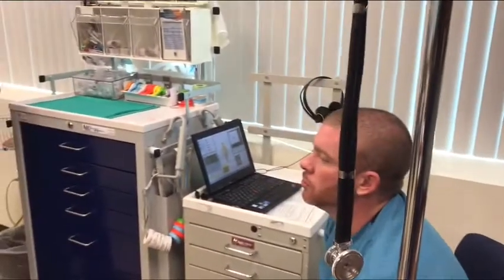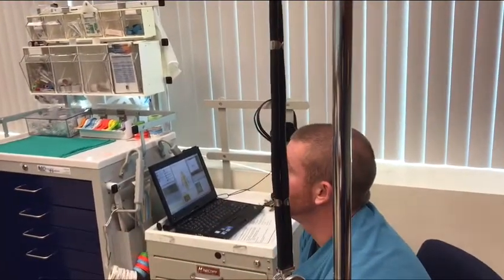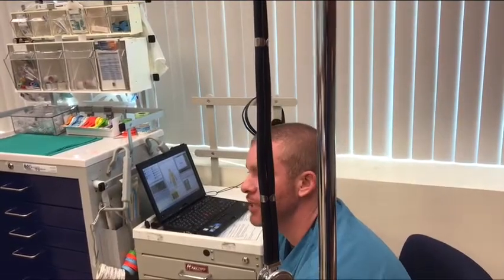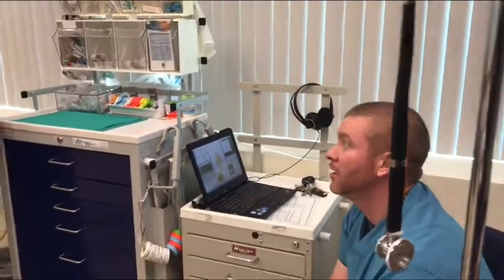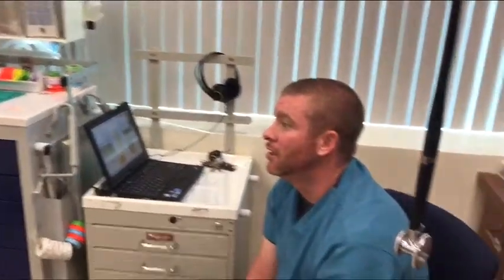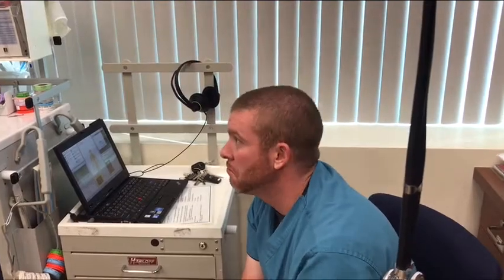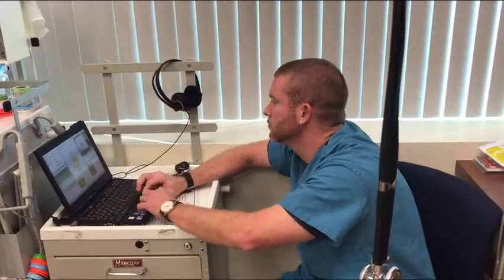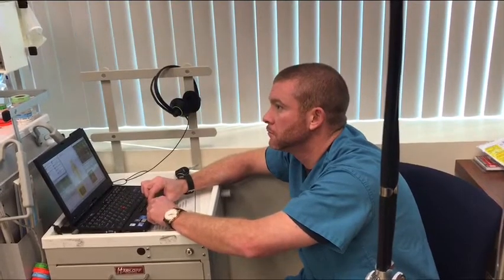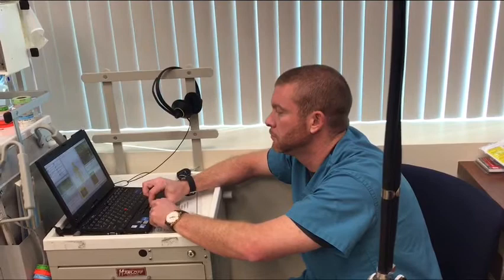Okay, so he's in maintenance. Did you give any other drugs? That's all I've given. I just put him to sleep just now and lowered the table. You heard them talking about they want to do the very slow. So I'm going to give another 50 to 100 micrograms of fentanyl prior to incision. Make sure that I have that. And make sure that my sevo reaches about 1.3 MAC before incision.